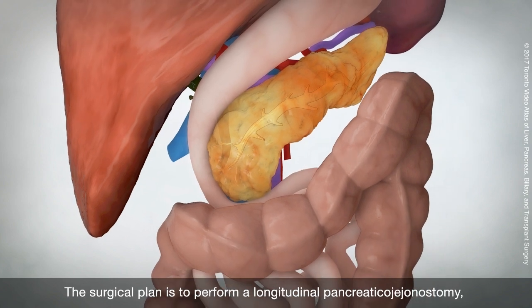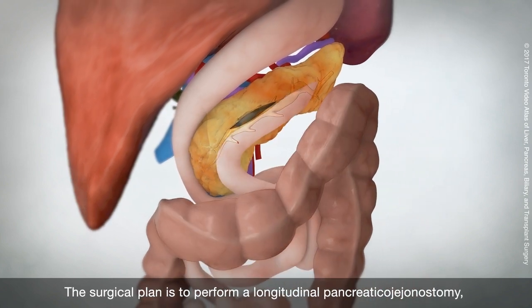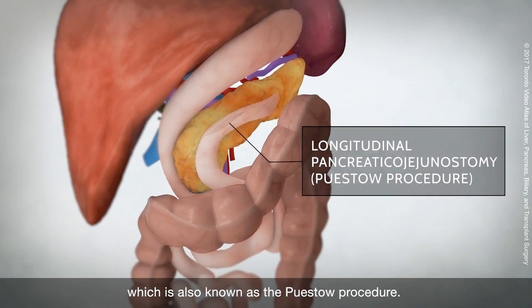The surgical plan is to perform a longitudinal pancreatic jejunostomy, which is also known as the Puestow procedure.